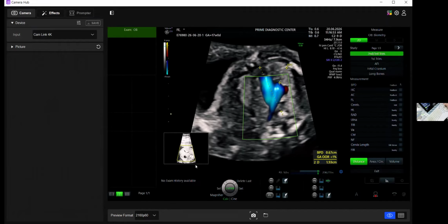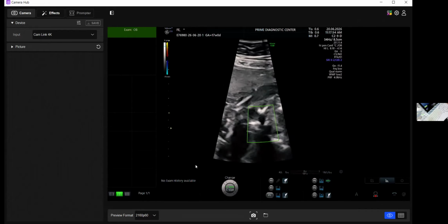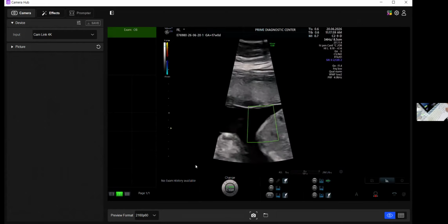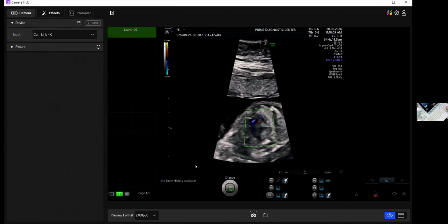Hyperplasia we are not very much interested in, but we are interested in hypoplasia. So then there are other ways of taking this, which was described, I think, by Devor, and let me see if I can do that. We should see the mammary arteries, and this is where we are. We reduce the Nyquist limit.